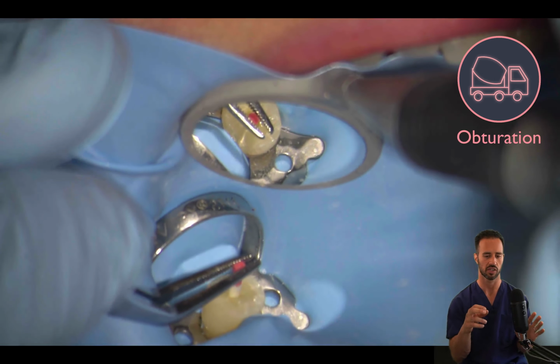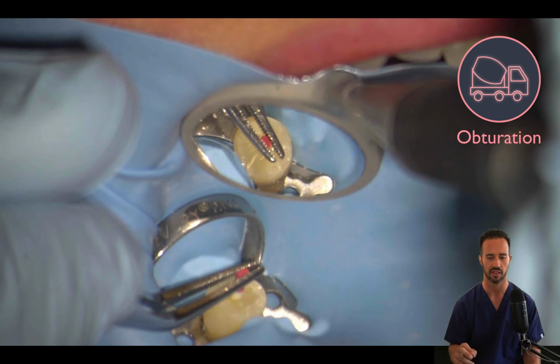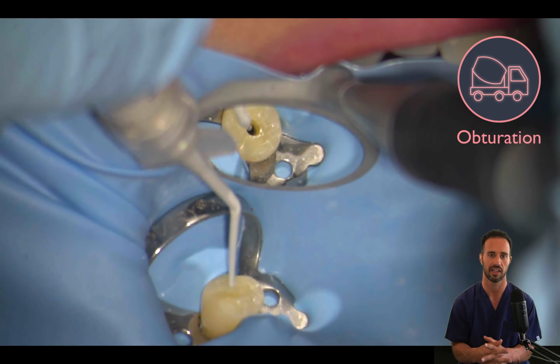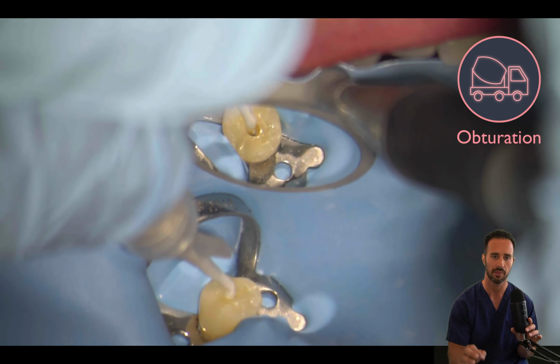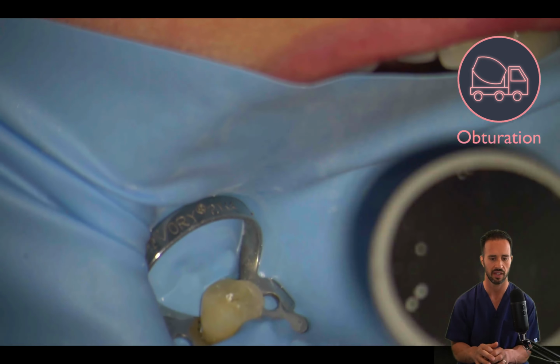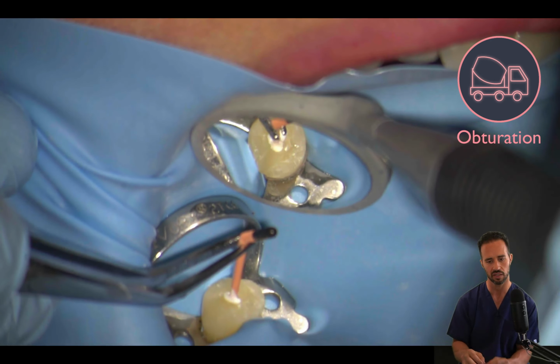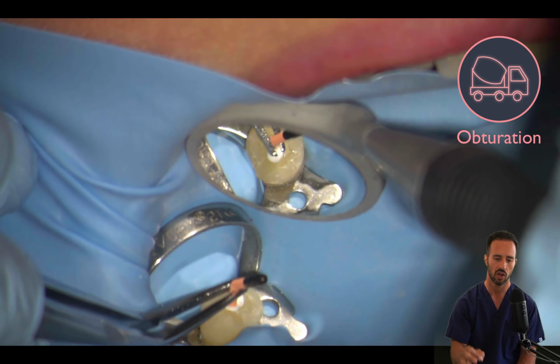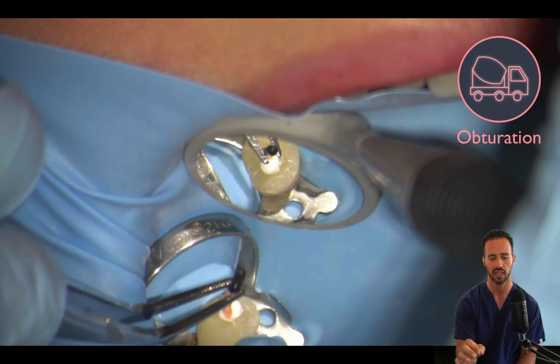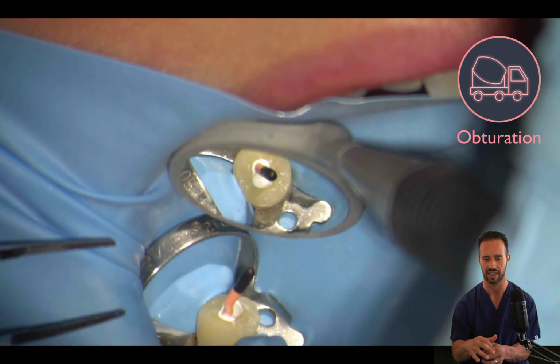So we're going to start with our ProTaper F2 paper points. That's the red that you see there. And those are nice because you really only need one of those to get the canal nice and dry. And this is our bioceramic BC sealer that we're going to squirt right into the canal passively, so we're not squirting anything out. And once we've dunked the cone into the tip of the sealer, we're going to go ahead and seat that cone all the way to length. You want to make sure that you crimp the gutta percha cone so that you have a really obvious reference point to go by to make sure that it's seated all the way to length.